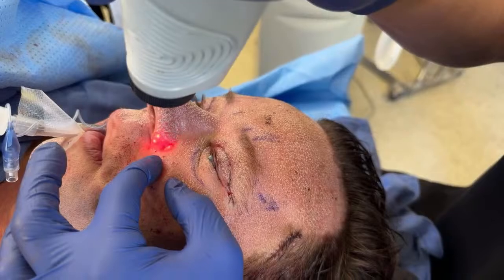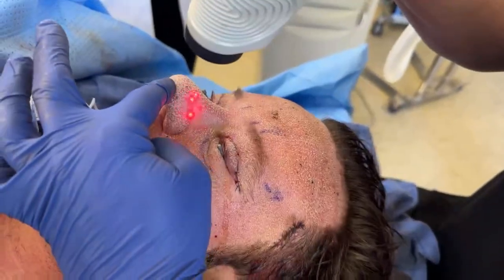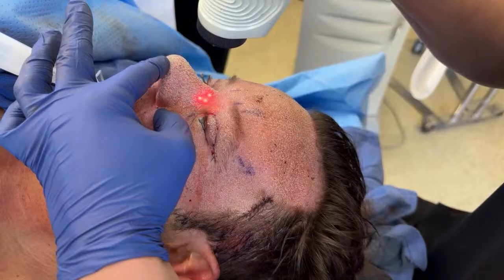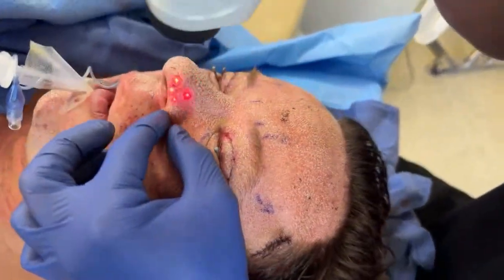So this is still considered a preventative treatment for him, even though he is reversing some of the sagging that's occurring with age. He's young. So this is going to give him a reversal plus a prevention with a lot of the rejuvenation that he's going to get from laser especially.